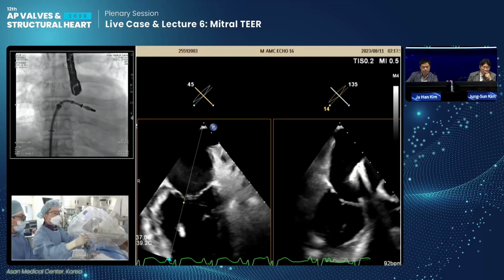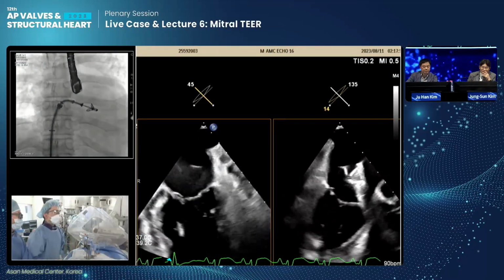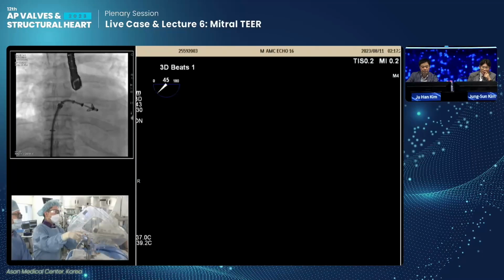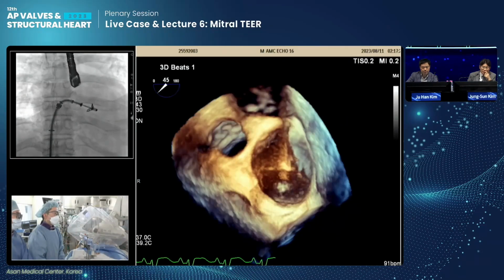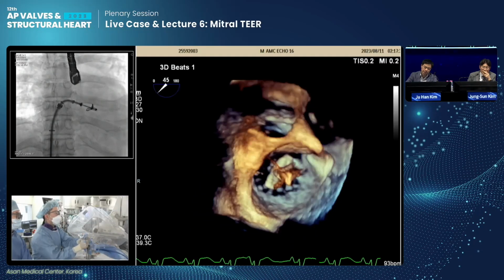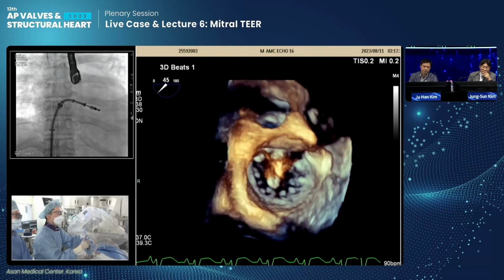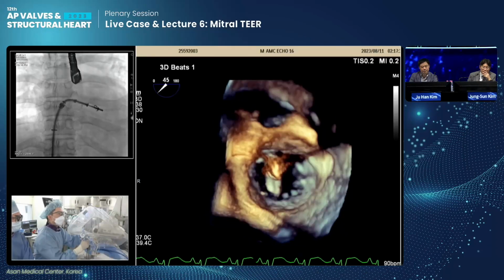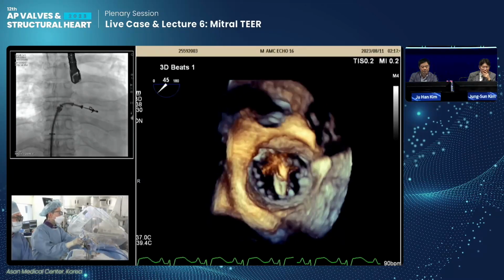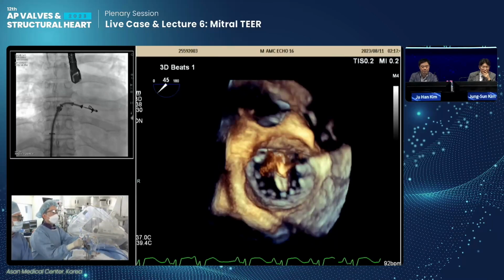Okay, open the clip, please. Yes, I opened. Yeah, let's move to 3D. Yeah, unpass it, please. Okay, counterclockwise, please. Okay. Yeah, 12 and 6 o'clock will be enough. Yeah, okay. Do you slightly like it? A little bit. A little bit more. Okay, let's move to explain.